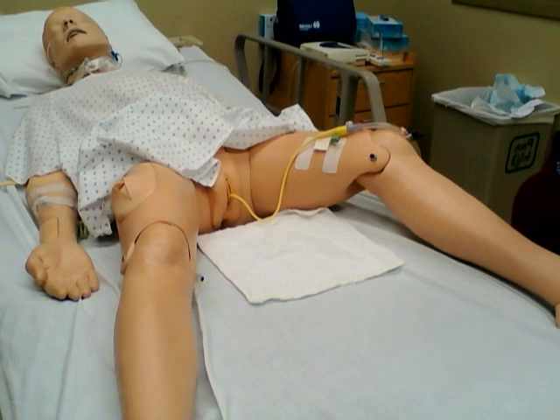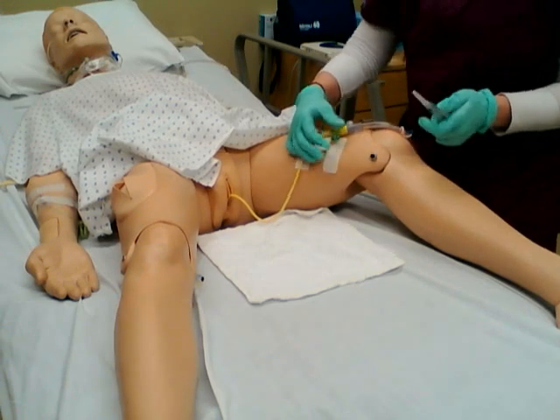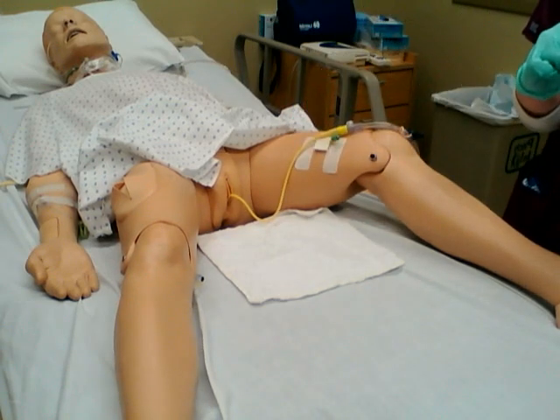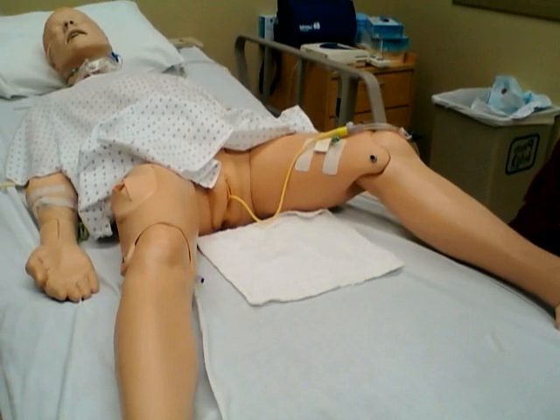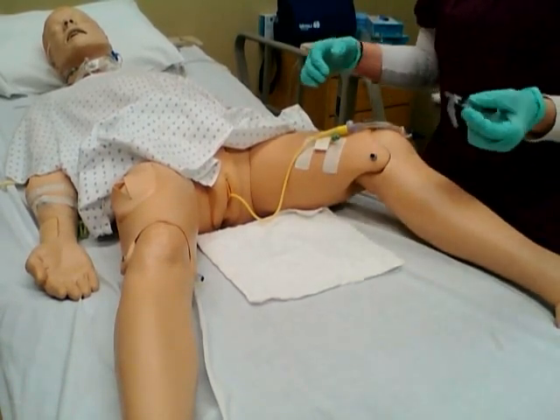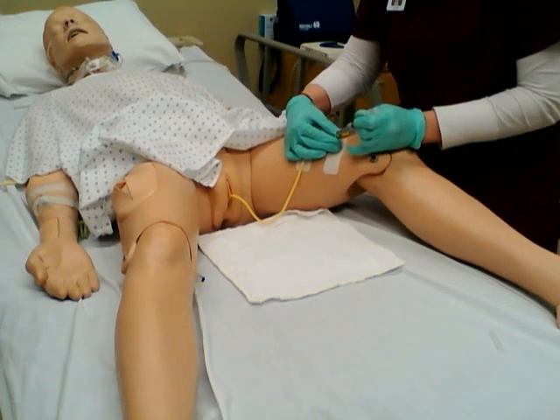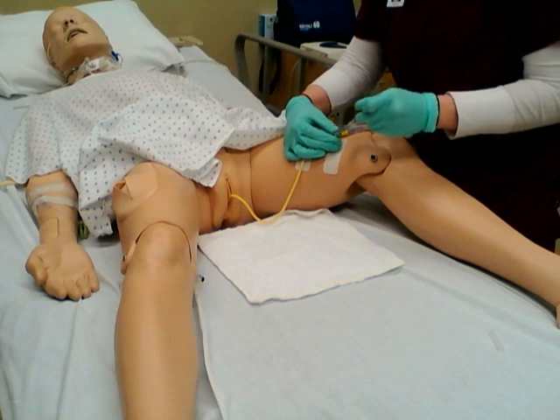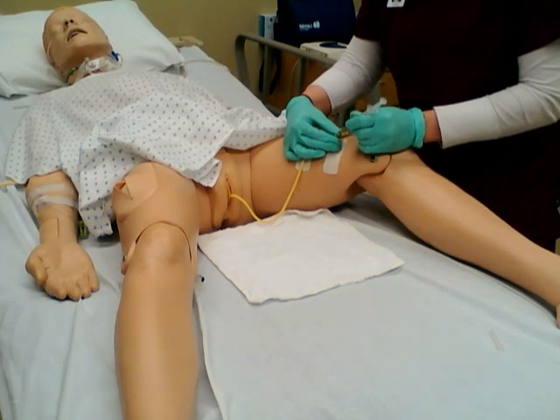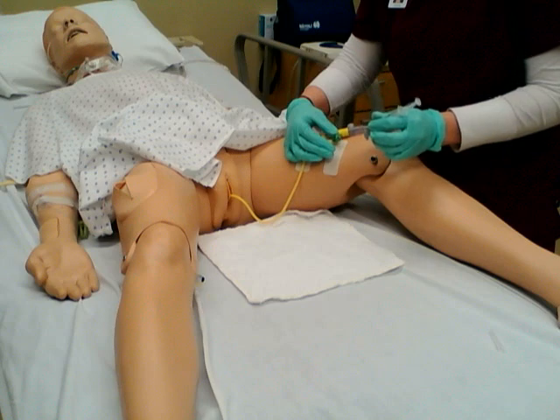I would take an alcohol swab and clean the top of this port so that you're not contaminating anything. Remove the cap from my needle and insert after aspirating. And then I would draw back. For the lab, you only need 10 mLs of urine. Then I would take off the syringe.